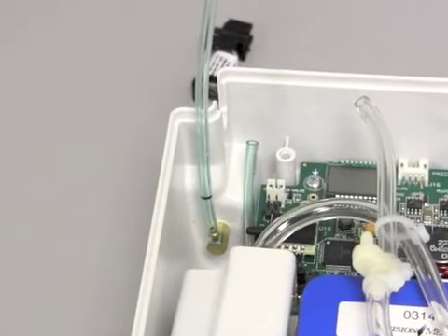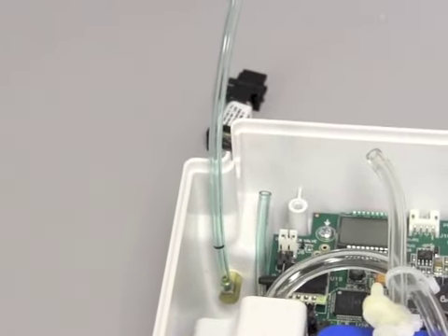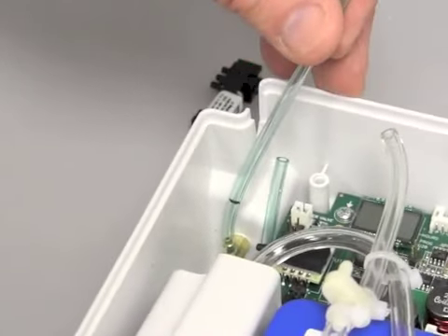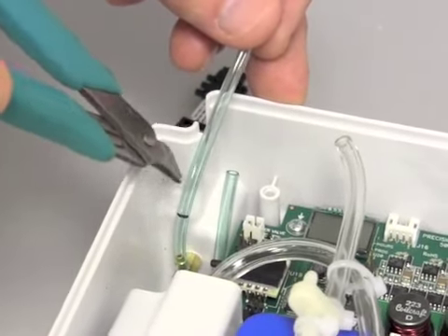Okay, our next step is to reinstall the 3-way valve back into the POC. And the first step you have to do for that is to cut the Tygon tubing that is supplied to you off the fitting. So it shows the black mark here. You want to cut the Tygon tube approximately where that black mark is.